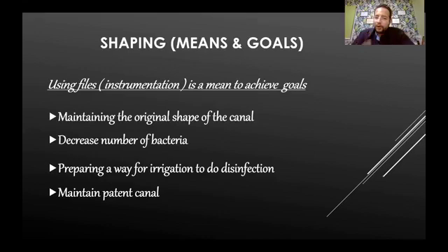So when you go for shaping in a wide canal with a 3-file system, you go through all the 3 files, reaching apex, but you don't cut anything. So you don't do shaping. You don't achieve one of the shaping goals, which is decreasing the number of bacteria. You don't achieve this goal, but you're still reaching apex, as most clinicians are deluded that reaching apex is the goal. No, you can reach apex, but you don't cut dentine, you didn't decrease the number of bacteria.